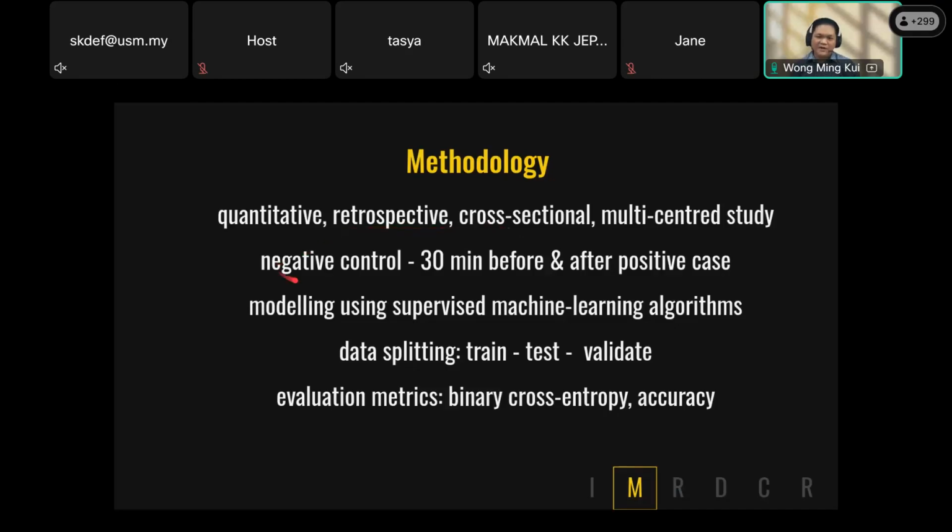Then next, for every positive FBC, positive FBC here means the sample for the FBC analysis contains malaria, is infected by malaria. So I'll call them positive FBC. In the same sense, negative FBC means that the FBC sample is not infected by malaria.